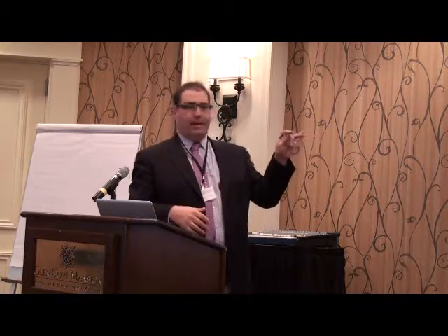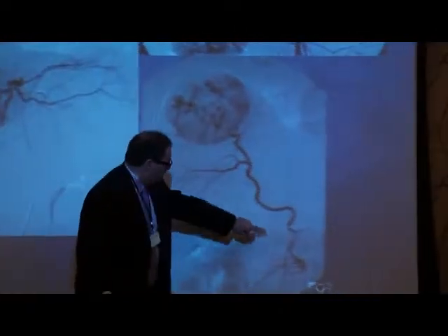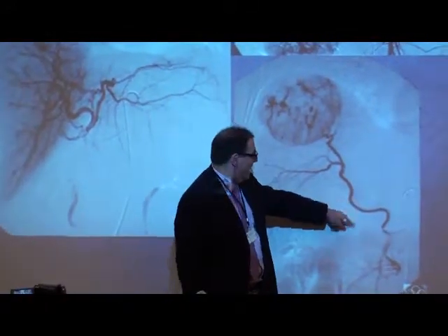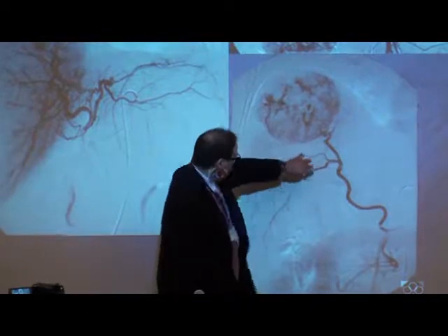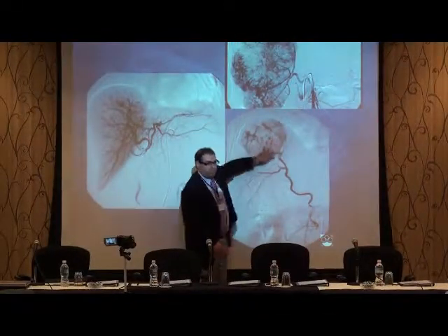Depending on how extensive the hepatic disease is, we can specifically navigate different catheters. Historically, we might have put a catheter here because of what tools we had and embolize this whole thing, even though these are normal arteries, this is the tumor, and these are the tumor vessels.